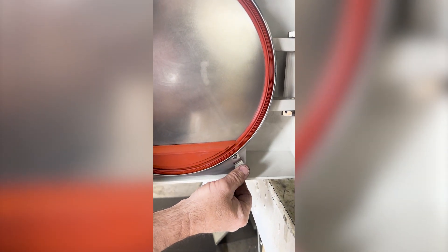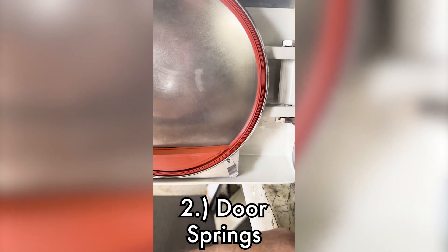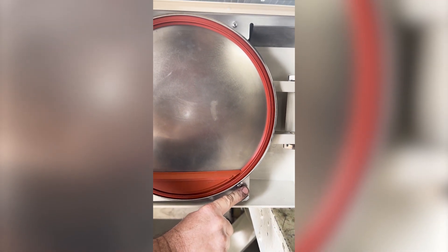Also, these have a pair of what's called door springs. This just helps assist to open up that door at the end of the cycle so you'll have proper air drying.